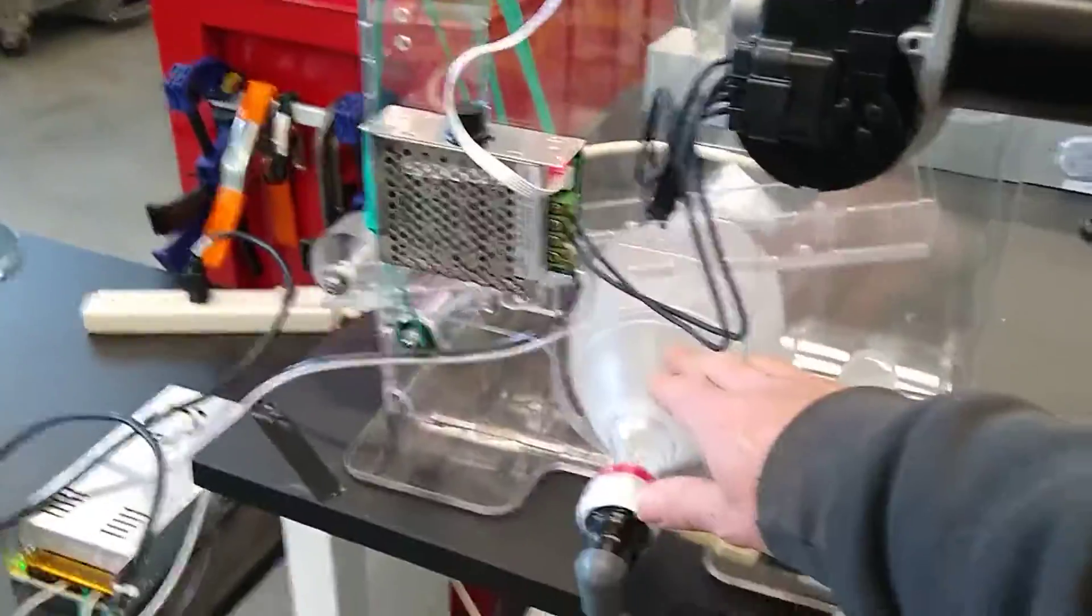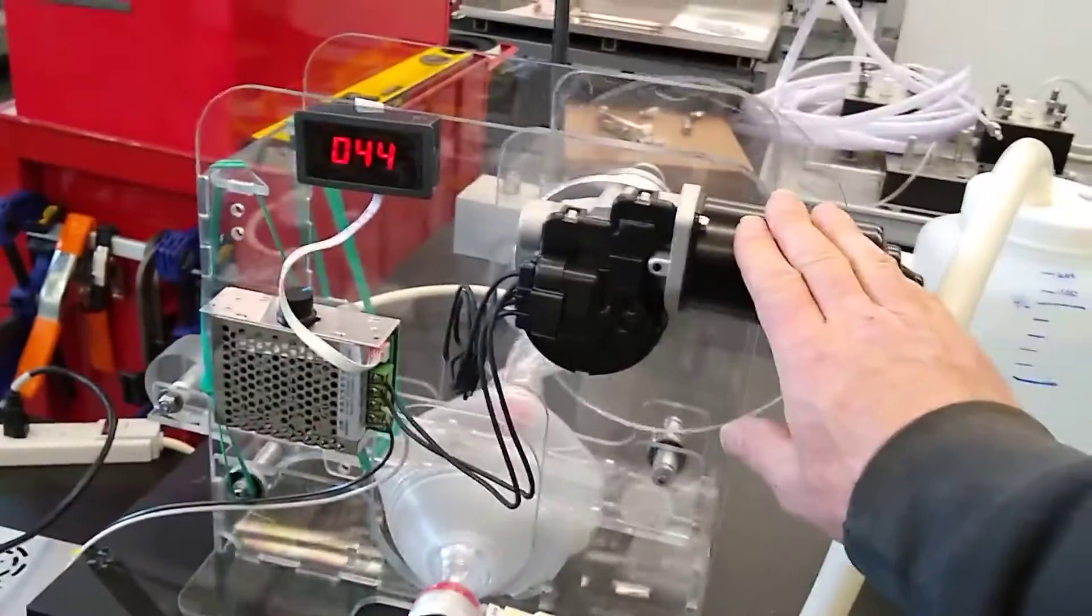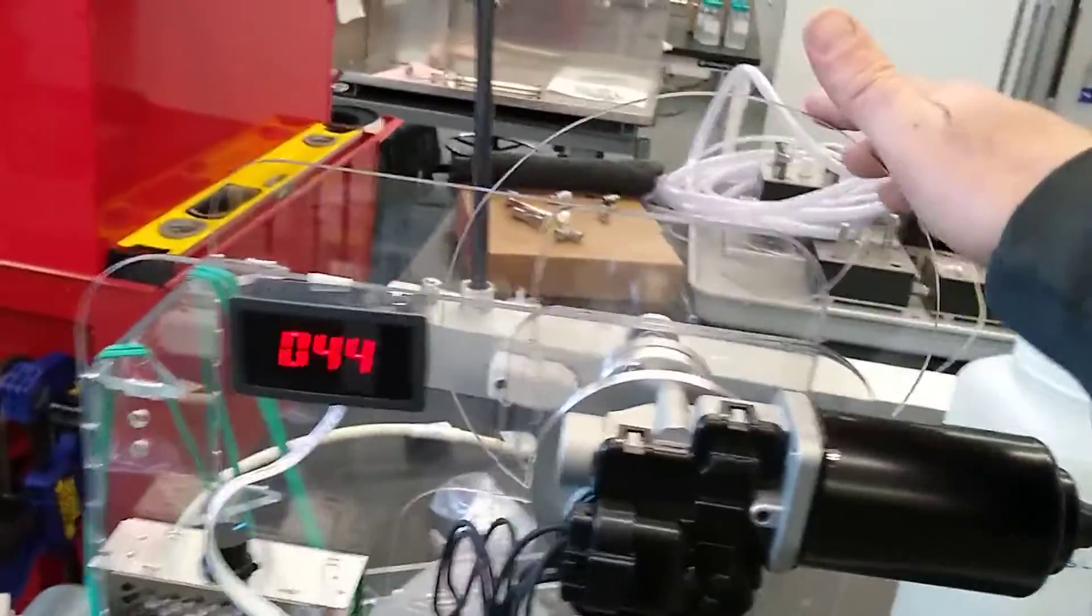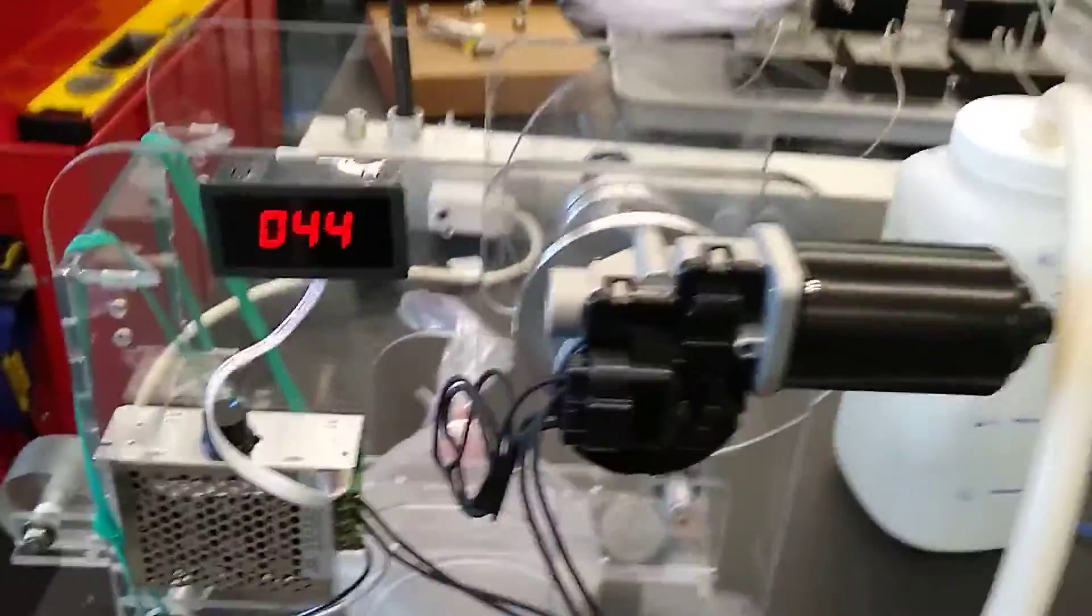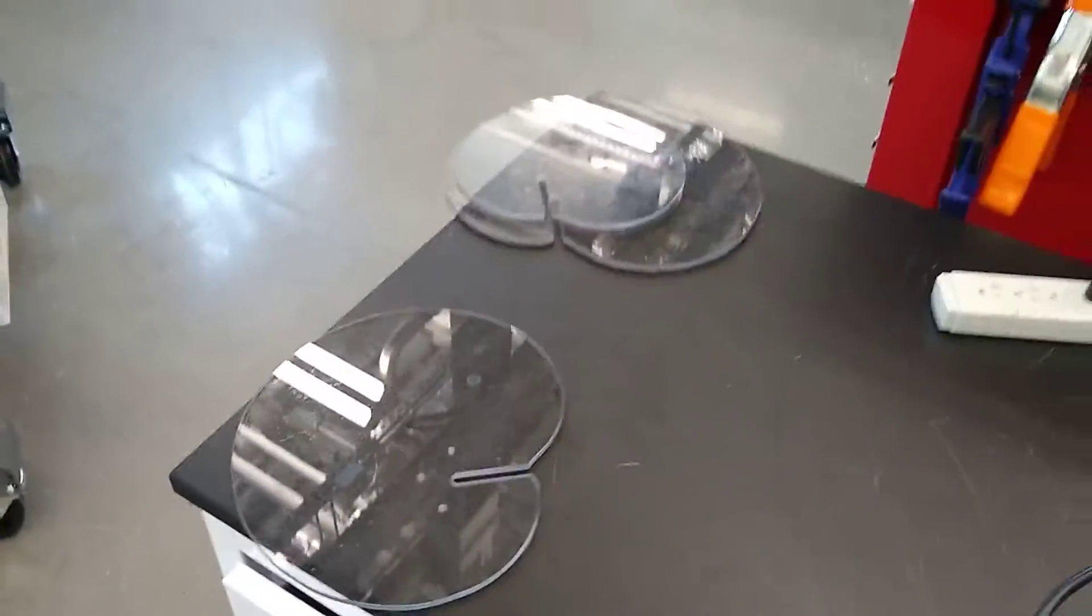What this device does is it squishes an Ambu bag, and this is a wiper motor. The wiper motor is being used to turn a cam, and we have various sized cams for various tidal volumes. Here are three other cams.